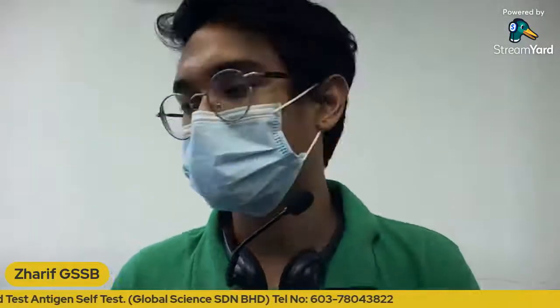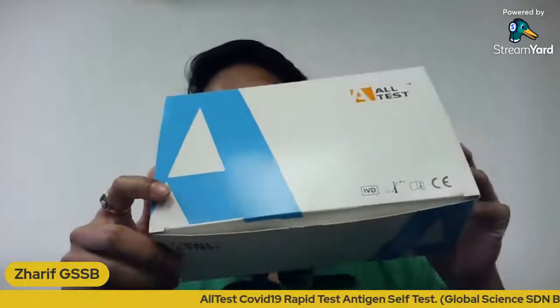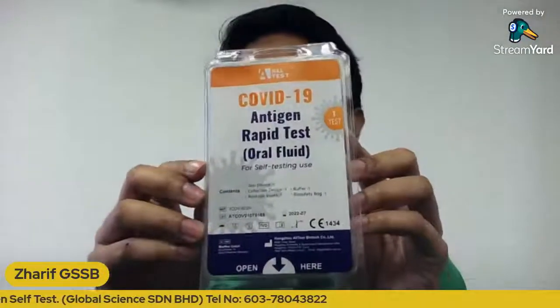Before I begin, there's an issue I would like to raise, which is the difference between pro-tests and self-tests. The pro-test looks like this, which comes in a box from Alltest as well. And for the self kit, the one being sold at pharmacies, it is this one.